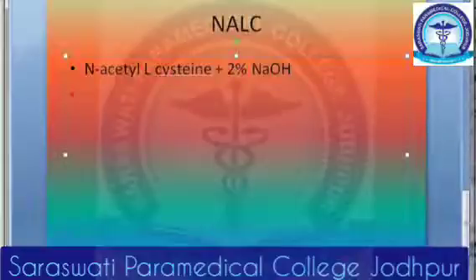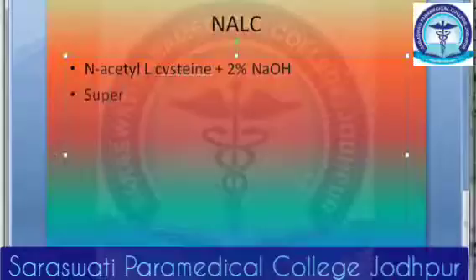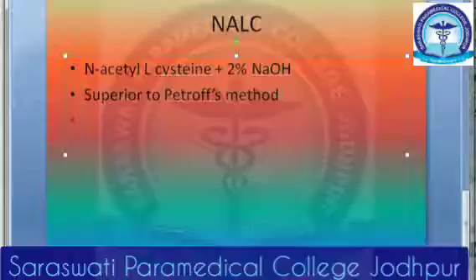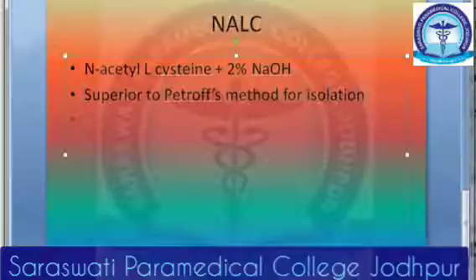This is superior to Petrov's method for isolation. Then NaLC liquefies the sputum and NaOH kills the normal flora.